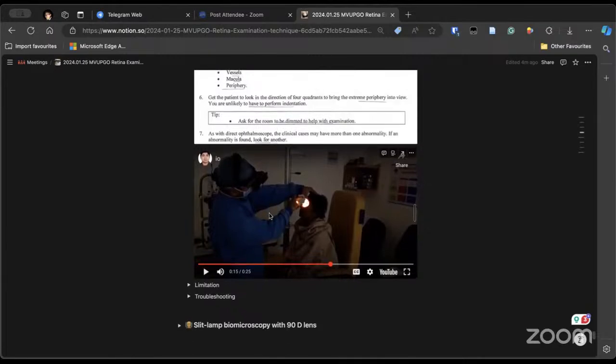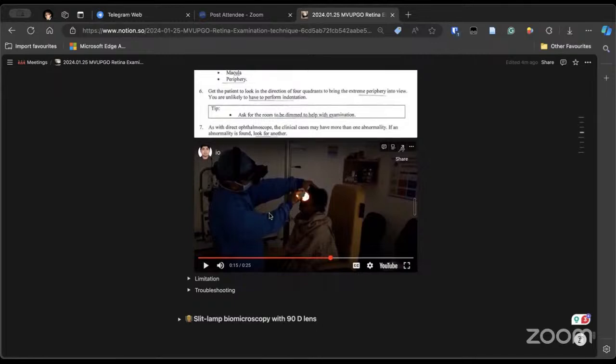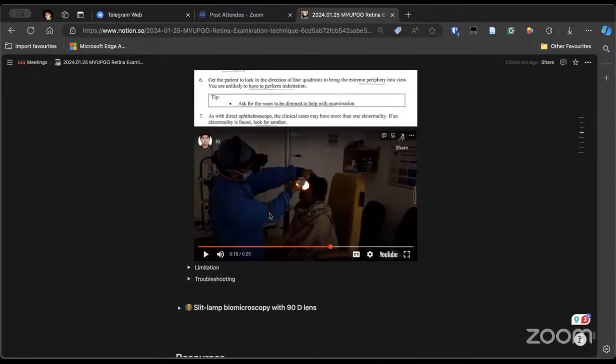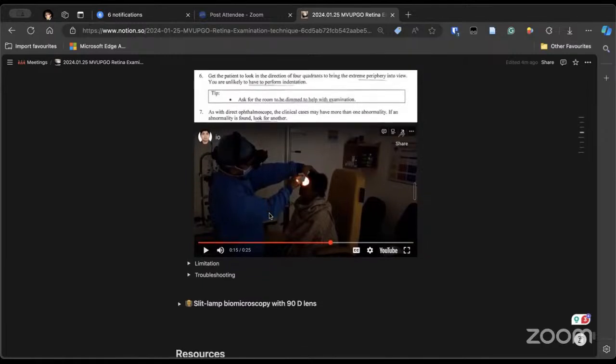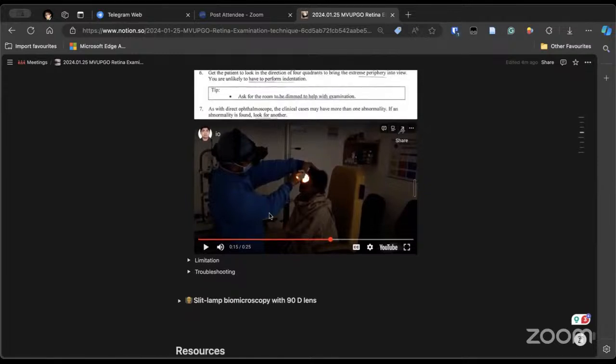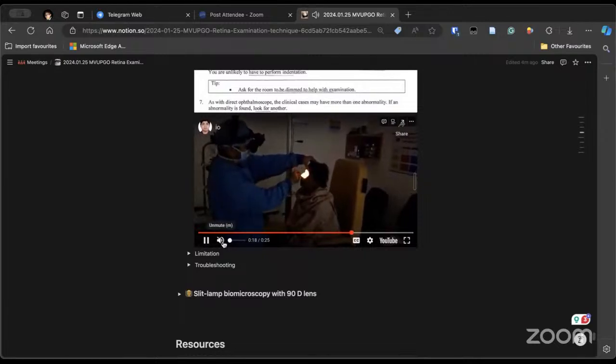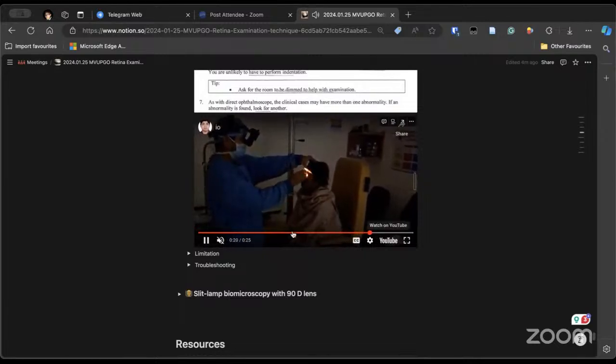So in that location, three things, your right eye, your left eye, and the light, might not be able to pass through that area. So if you rotate or make your head horizontal, then the light and your one eye, here your left eye, can go through the small pupil, and you can examine the peripheral retina. Though it will be a uniocular exam, you will be able to see the periphery. Is there any difficulty in understanding this? Yeah, sir. Can you please repeat?